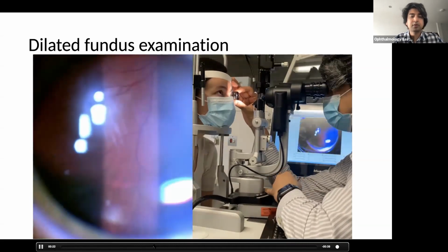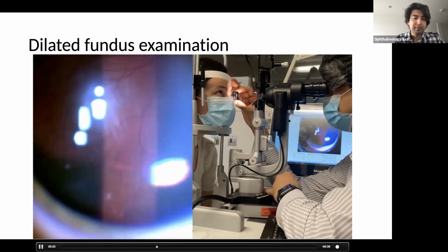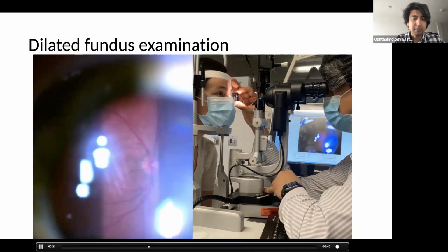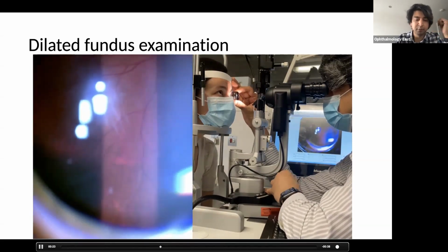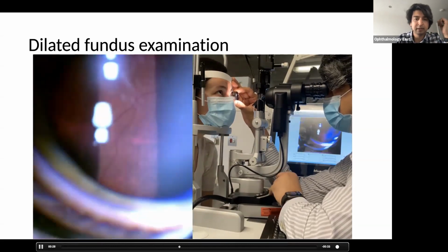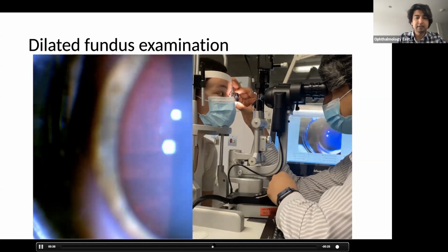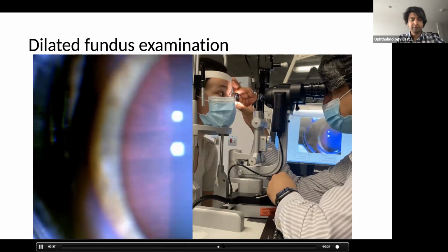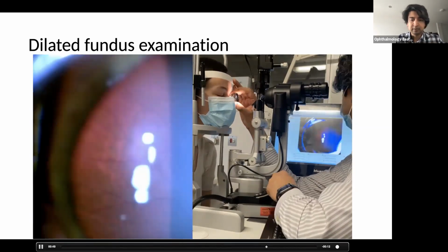So when you look through one of these lenses, everything is upside down. So it means when I get the patient to look up, the bottom bit of the lens is the top bit of the retina. So that's the more peripheral bit. And same again, if I get them to look to the left, the left bit of the lens is the peripheral retina. And then down and right.